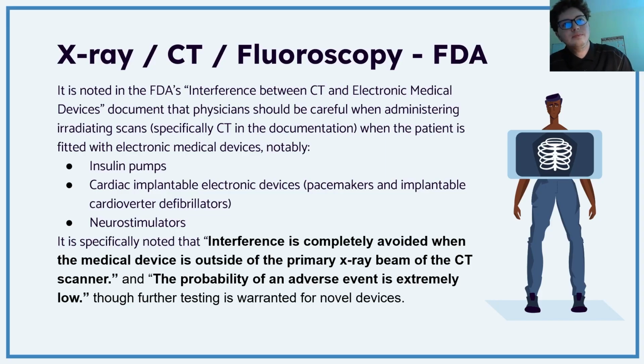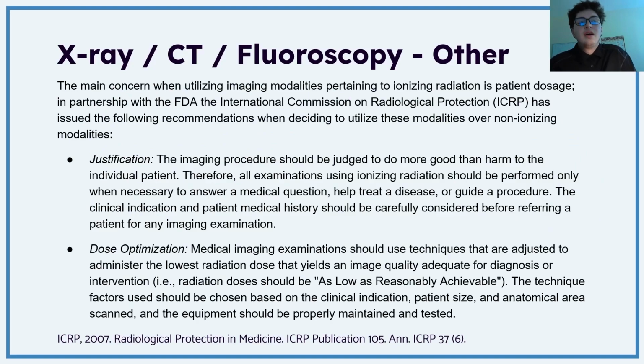So, outside of the FDA, but still kind of in the FDA. The FDA partnered with ICRP to make a few statements, just talking about patient dosing. We need justification that the procedure is judged to do more good than harm to the individual patient, and that the dose optimization is up to date.